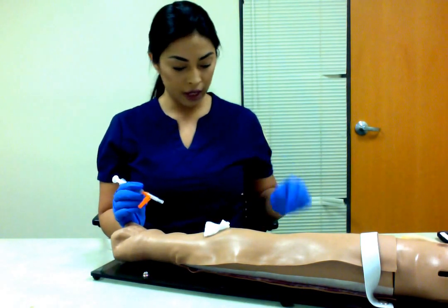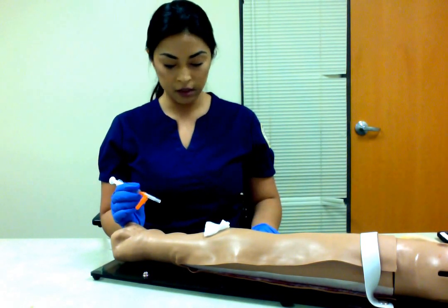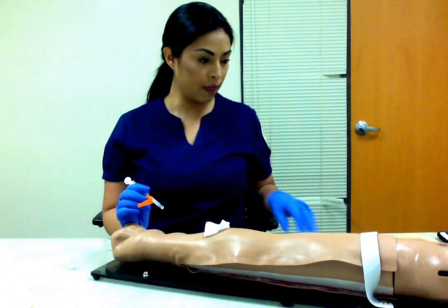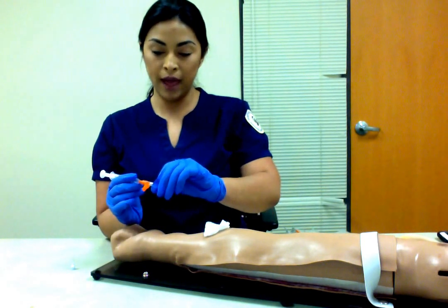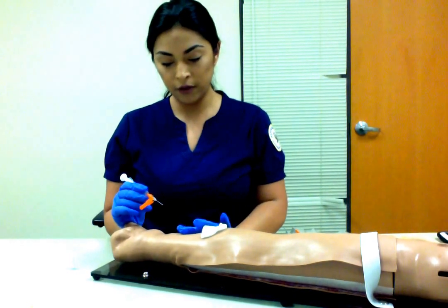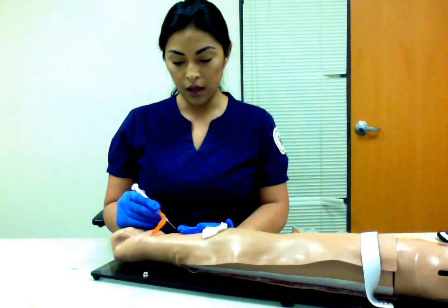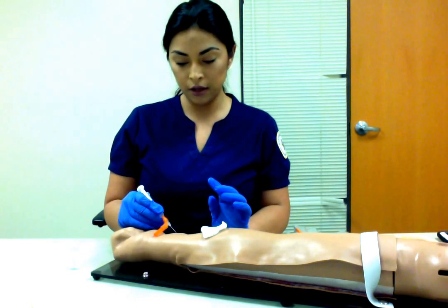And at this point, your bubble cap is ready. And I would place it right here. And my biohazard bag is ready. I can remove the cap and feel for the pulse, and then go ahead and stick the needle in.